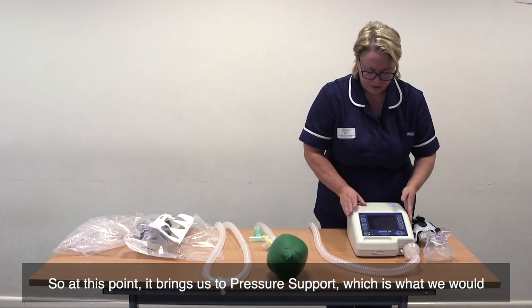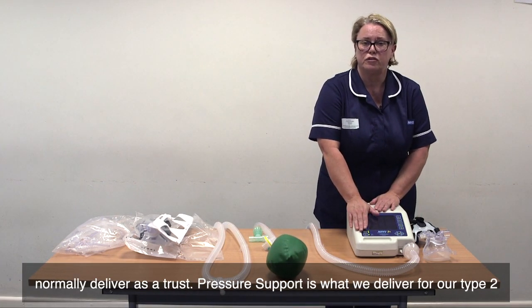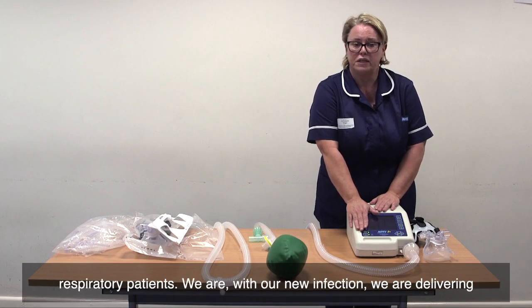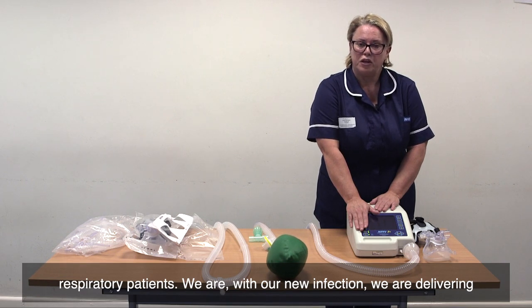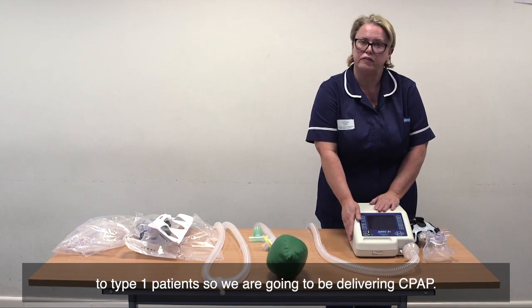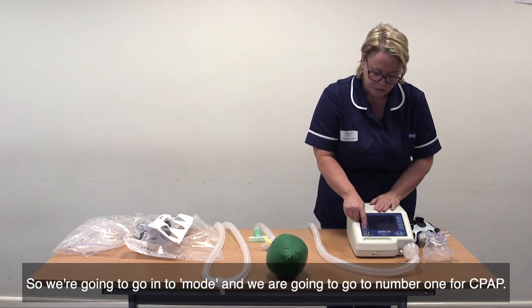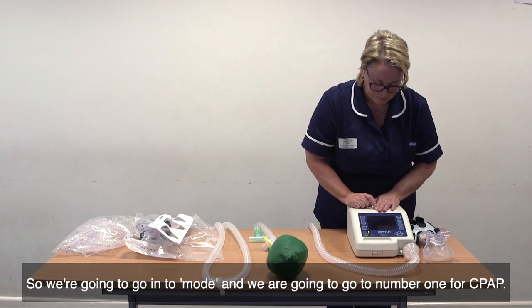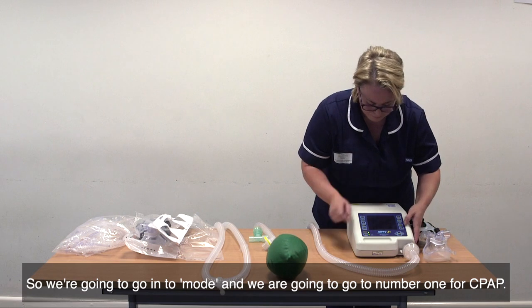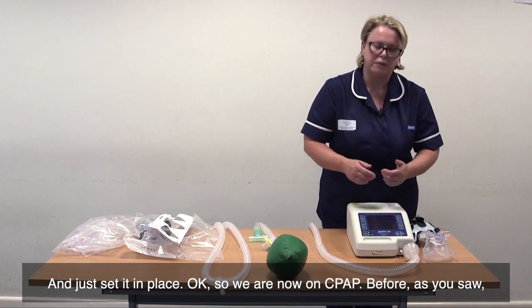So at this point it brings us to pressure support, which is what we would normally deliver as a trust. Pressure support is what we deliver for our type 2 respiratory patients. With our new infection, we are delivering to type 1 patients, so we are going to be delivering CPAP. We're going to go into mode and go to number one for CPAP, and just set it in place. We are now on CPAP.